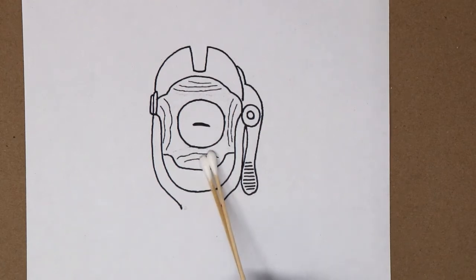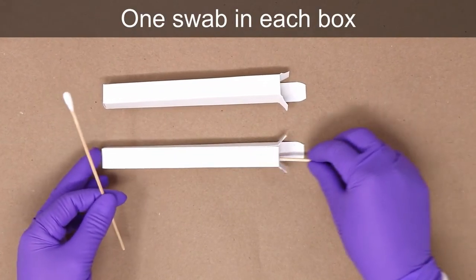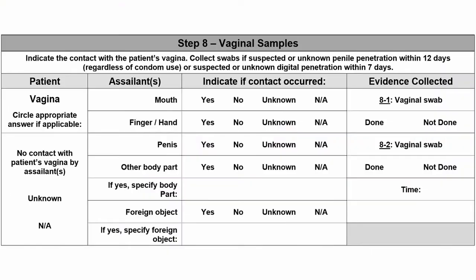2 swabs should be collected simultaneously of the vaginal fornix, not the cervix. The area should be thoroughly swabbed. The swabs are then placed into individual swab boxes, sealed and labeled appropriately. The paperwork can then be completed.